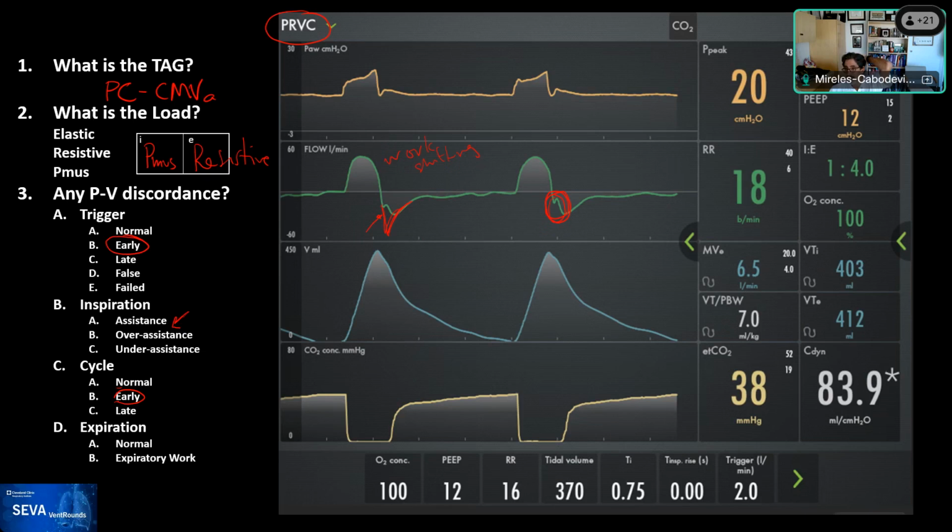Yeah, exactly, Ariel, exactly. But the flow doesn't lie. And that's why your eyes look at the flow. Right. Your eyes look at the flow. That's a good way to explain it, Ariel.